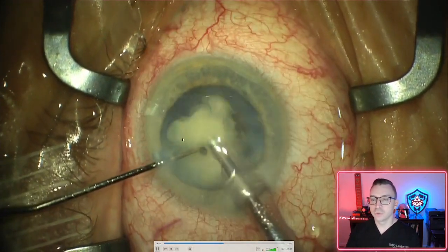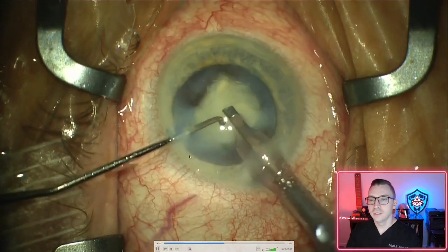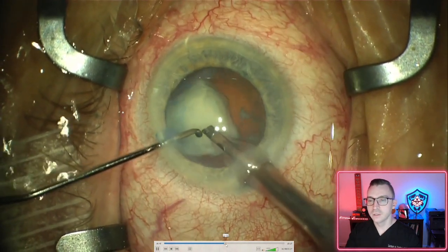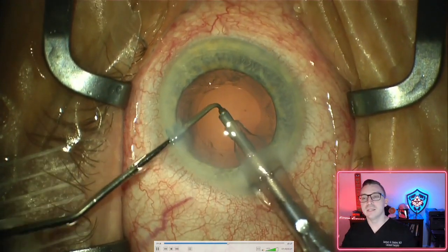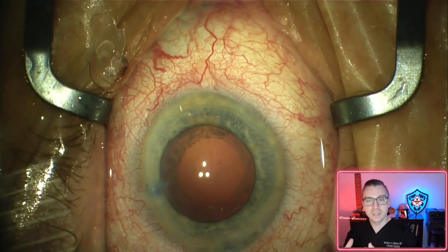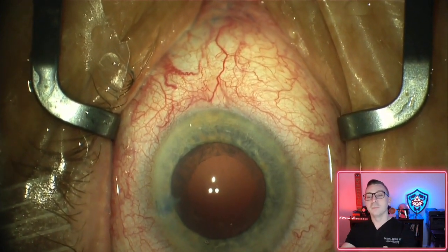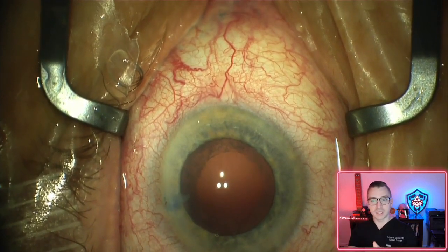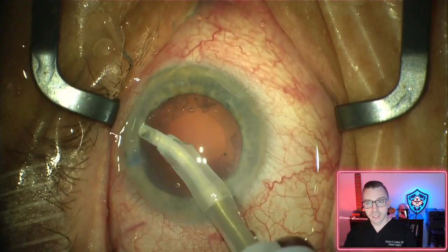So here's quadrant number 3 coming out nicely. No issues at all. Let's get quadrant number 4 out of here. There we go. Came out just fine. Now we can really see a nice, beautiful red reflex here. This is the light now coming into the eye, passing through the cornea. There's no lens here, but passing through to the retina now, and we're seeing that red reflex of light back off of the retina. And that's what you want to see. Now this patient's going to get light into his eye. But we're not done. We're not done yet.